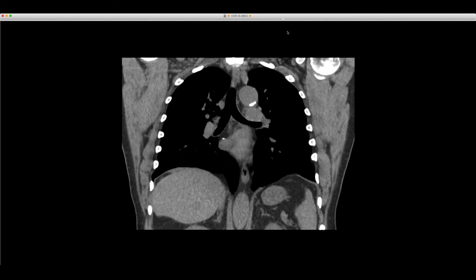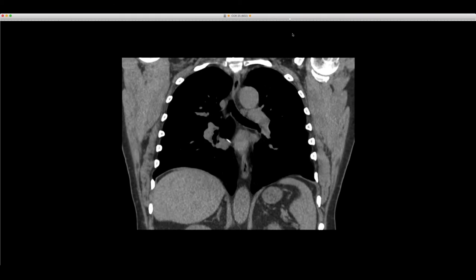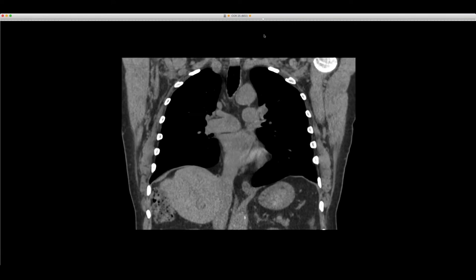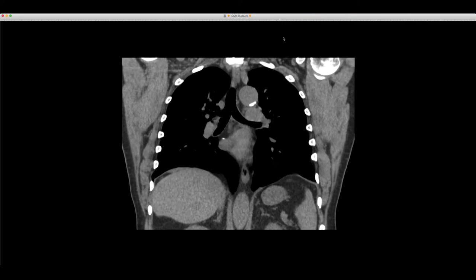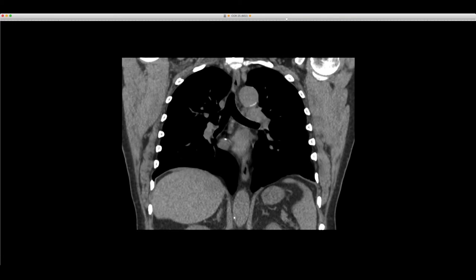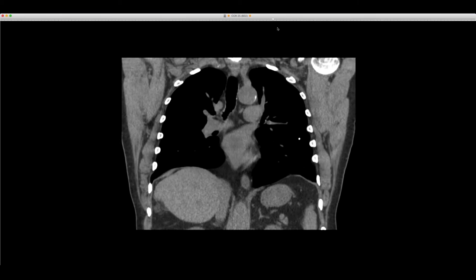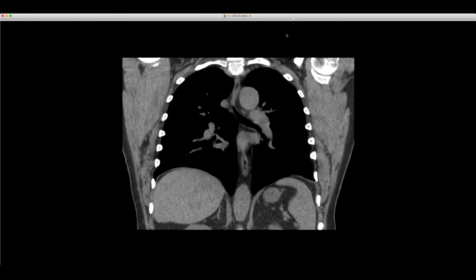What do you all think is the route here? We've seen them in the pericardium, we've seen them in the myocardium, we've seen them in the mediastinum adjacent to the heart and pulmonary arteries. But how do you all think this happened? I couldn't think of a good pathway, unless it's in the little pericardial sleeve there, but I don't know. Oh, maybe it is. Maybe it went into the pericardial sleeve and then perforated or something. Yeah, I just thought that was a very interesting sequence there.